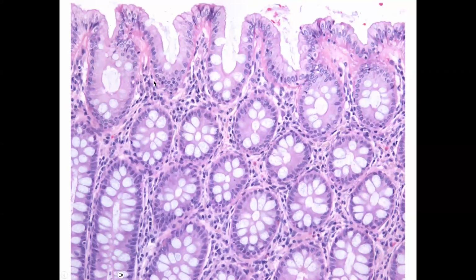Looking on higher power to some of the histology here, normal colonic epithelial cells, like other epithelial cells in the gut, have basally located nuclei. The nuclei are not dark staining, they're not piled on top of one another. You can pick out individual nuclei very easily. And again, I just want to reiterate, look at how uniform these crypts are, one right after another, regular spacing, all oriented the same way. It looks like an Andy Warhol painting.